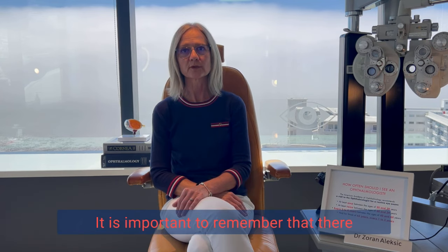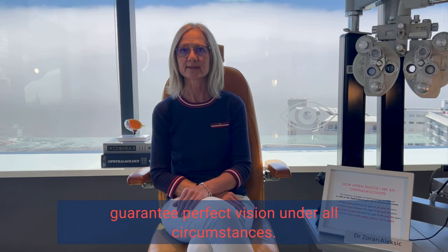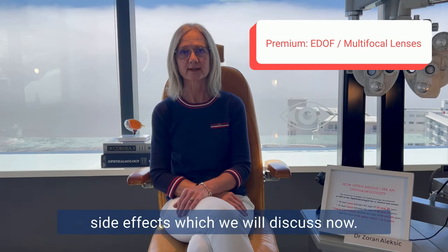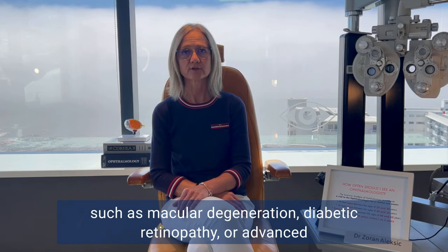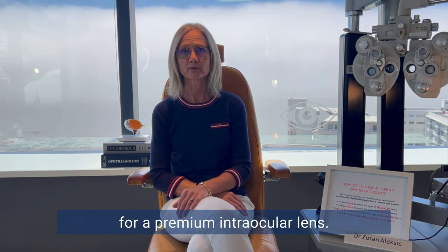It is important to remember that there is no intraocular lens option that can guarantee perfect vision under all circumstances. Even the premium lenses have limitations and side effects, which we will discuss now. If you suffer from any pre-existing eye conditions, such as macular degeneration, diabetic retinopathy, or advanced glaucoma, you may not be a suitable candidate for a premium intraocular lens.